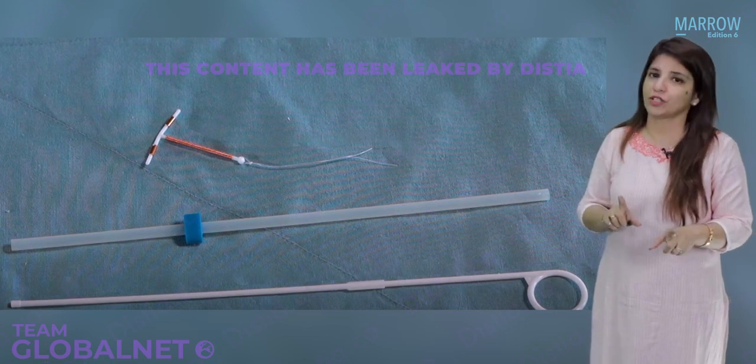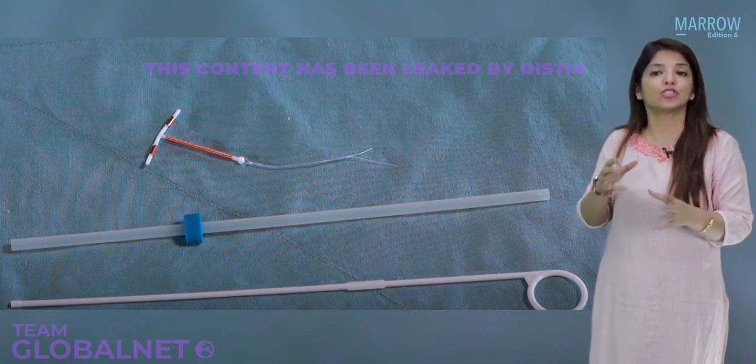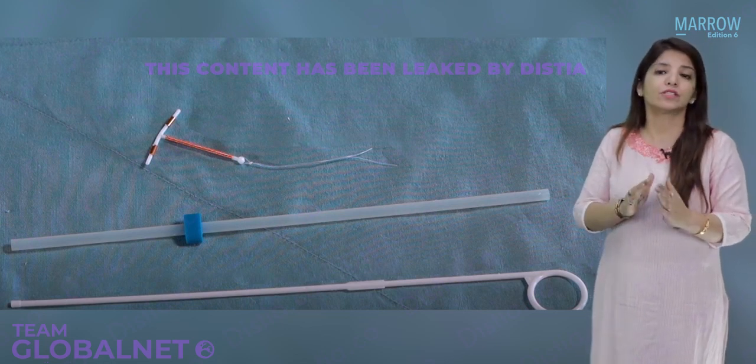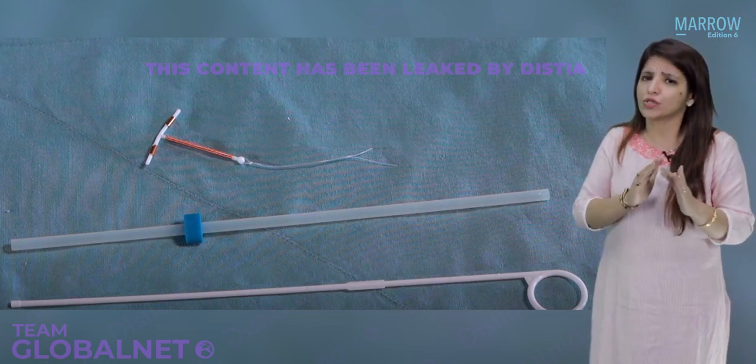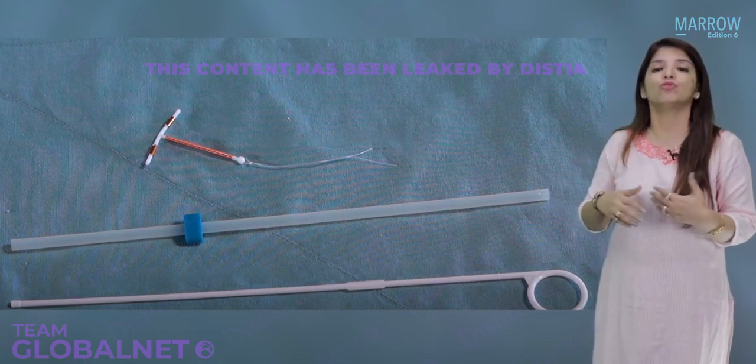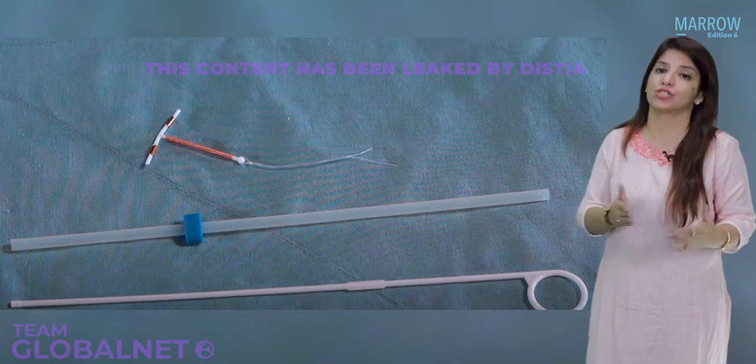Now, one very important thing which you have to remember is that chances of infection are maximum while you are inserting the copper T. So there is a no touch technique. You don't have to touch the copper T while you are loading it. So now I'm going to show how to load a copper T without touching it.